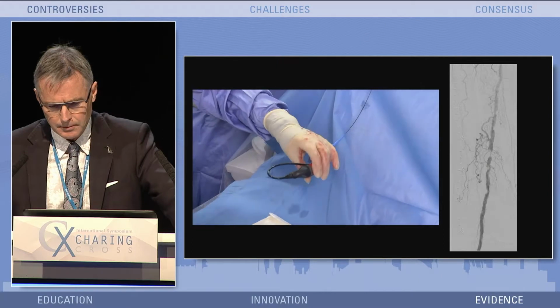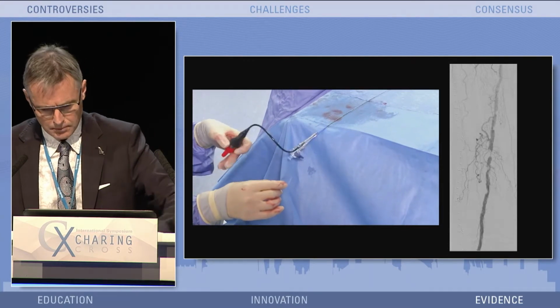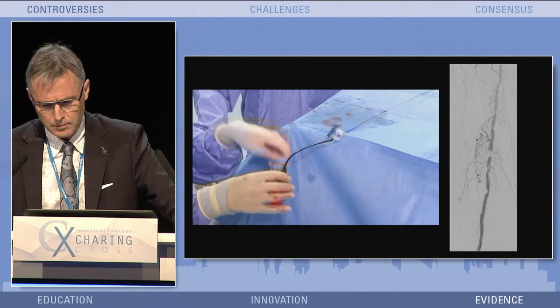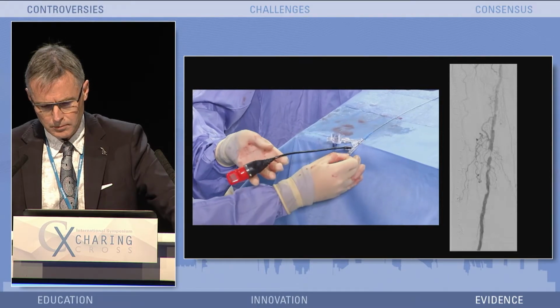The catheter over the 014 stiff guide wire. Thanks to the design of the nose cone, you got that fixed. And the catheter itself, I find that this will primarily deliver through critical stenotic disease very nicely. If we can go to medium resolution, thanks, and we won't have overlay on at the moment.